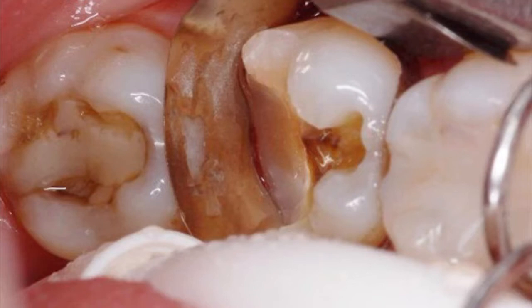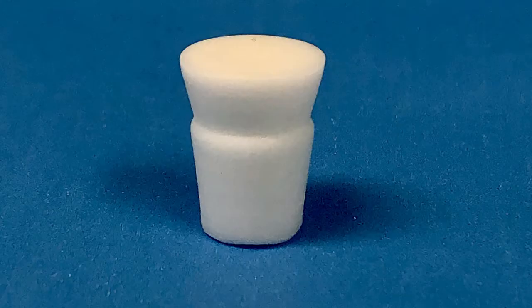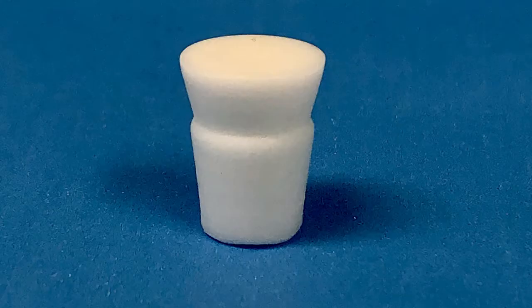Let me assure you, it is easy to learn. Master this and composite restorative dentistry becomes much more predictable. Working with this simple practice tool will have you well on your way to making contact openings correctly.